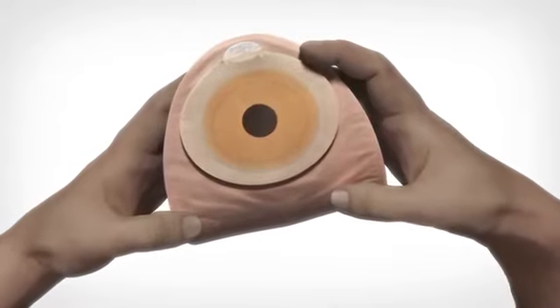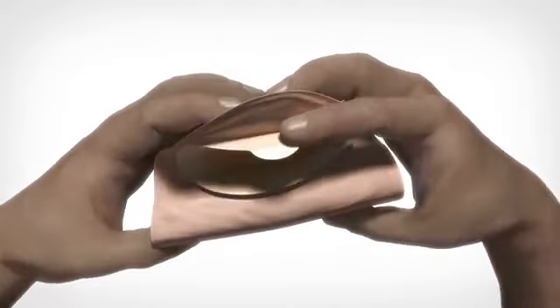To seal the contents in the bag, fold the adhesive in half before disposal.